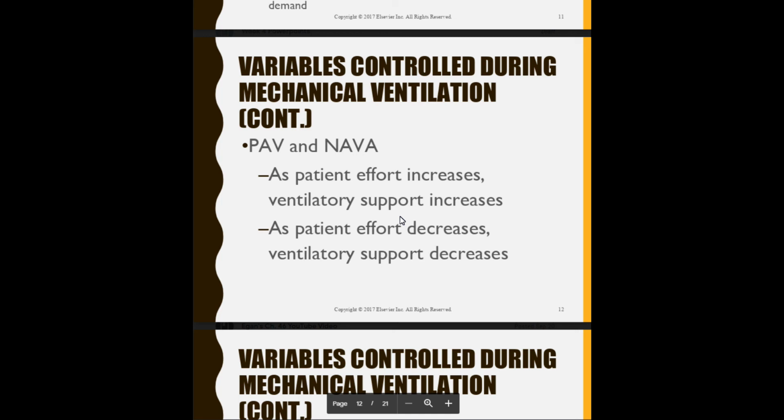Depending on the patient, if the patient effort increases, ventilatory support increases, and vice versa. So these are great in terms of having the patient breathe on their own, and we have less interference and therefore less control, which leads to a decrease in the asynchrony.